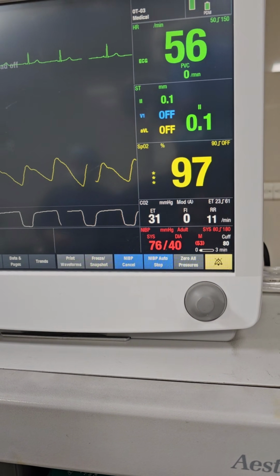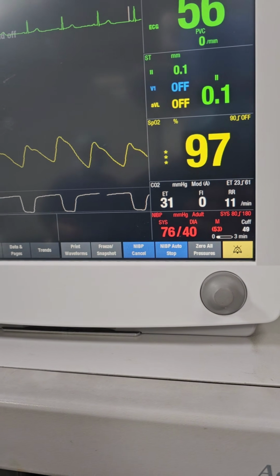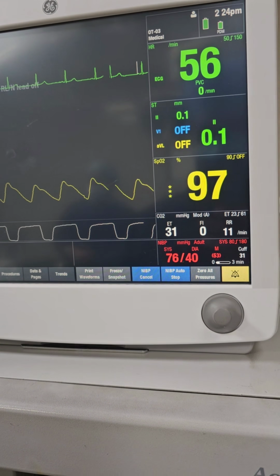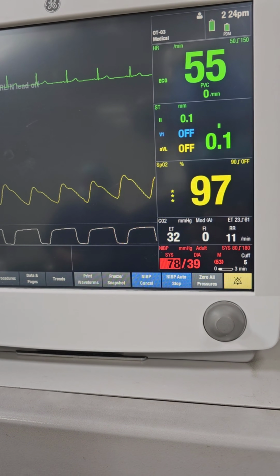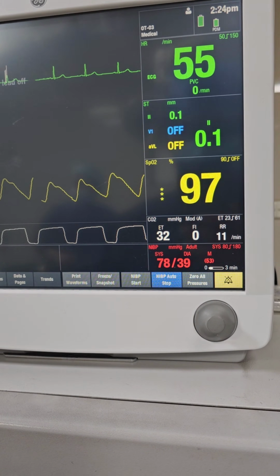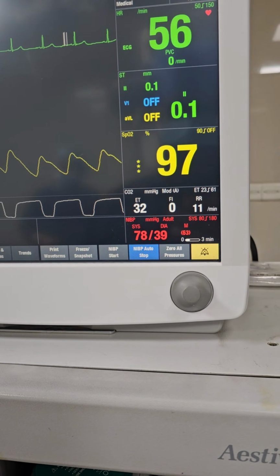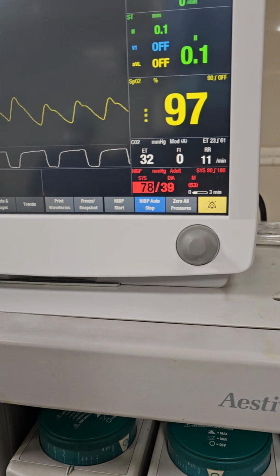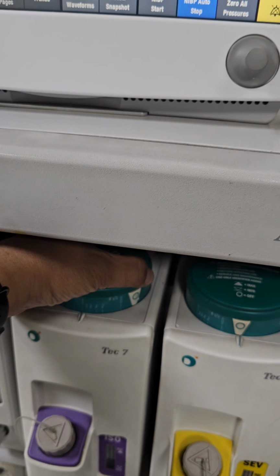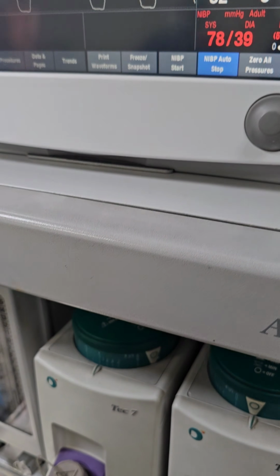But she is a very young patient, in the middle age of 30 to 40, so we are not expecting that a very short time reduction of blood pressure will affect the perfusion or cause any untoward event. There is a slight increase of systolic pressure, and mean pressure is actually 53, so we reduce the isoflurane to some extent, 1.5 to 1%.